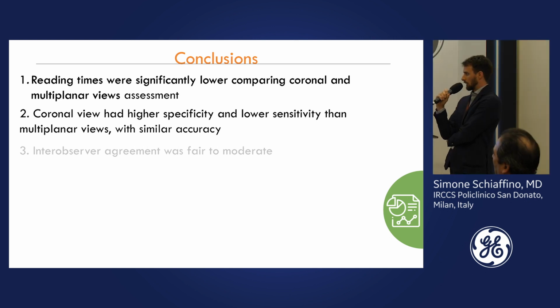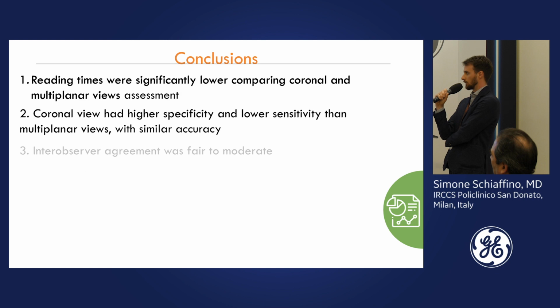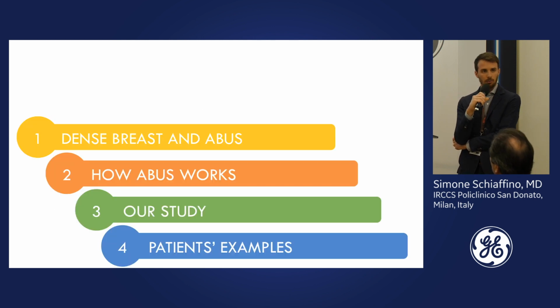In our opinion, the assessment of the coronal view alone can be considered a brief preliminary approach, and in case of the detection of a potential lesion, the reader can analyze all the different planes to confirm or not, and the complete assessment of all the available planes is still recommended. If you have some questions, we can see some pictures, and if you want, we can watch some cases at the workstation, or we can discuss.